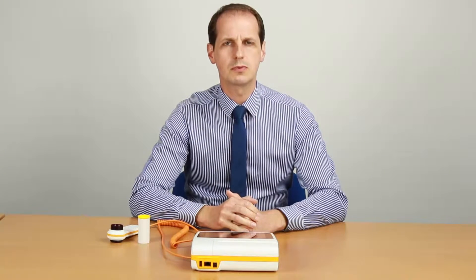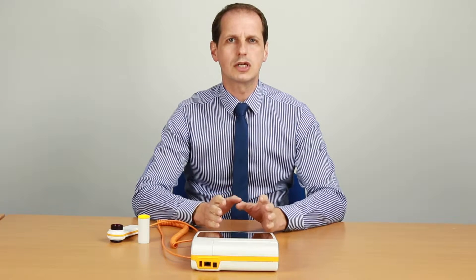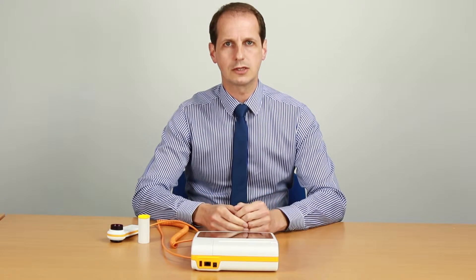Welcome to the online demonstration for the Spiralab Desktop Spirometer. The Spiralab Desktop Spirometer has a rechargeable battery which can be charged from the mains. You can use it whilst it's charging and also remotely on the battery.